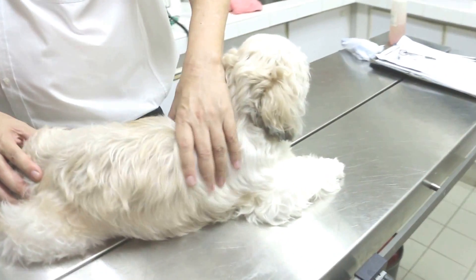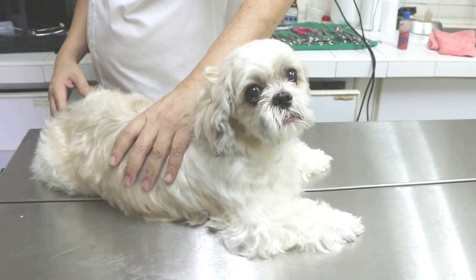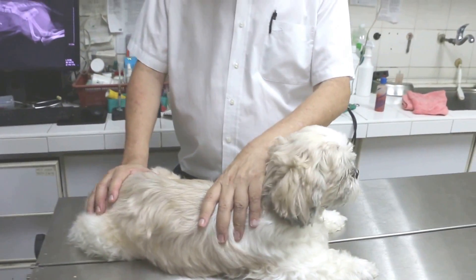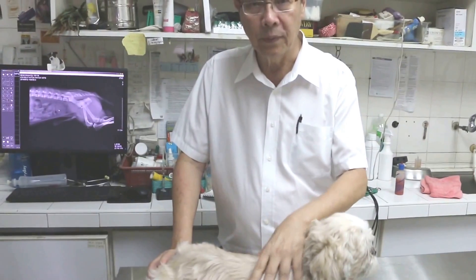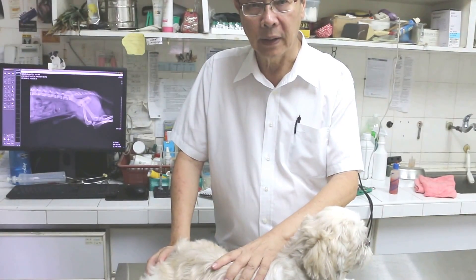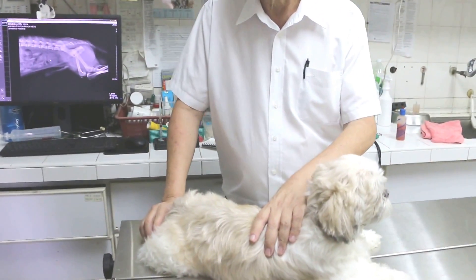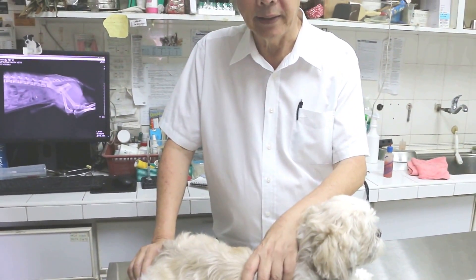So this is a male Shih Tzu, not neutered, 10 years old. You have to state the patient first: male Shih Tzu, male, not neutered, 10 years old. Now what's the complaint? The complaint — from the owner — is that he passes blood in the urine now and then.